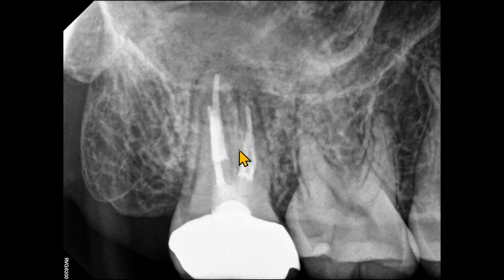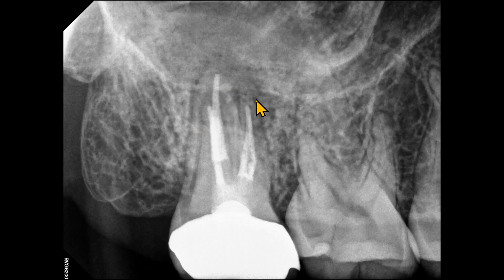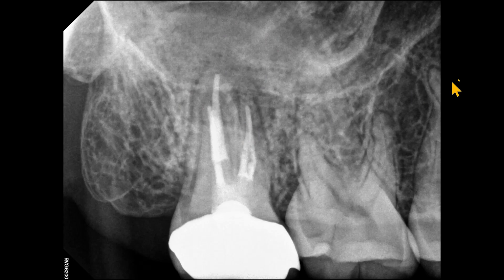Because these are two-dimensional images, we do not have any information about the status of the buccal cortical plate or the palatal cortical plate. We have a small field of view CBCT scan to review the floor of the sinus, the cortical plates, and the status of the roots.